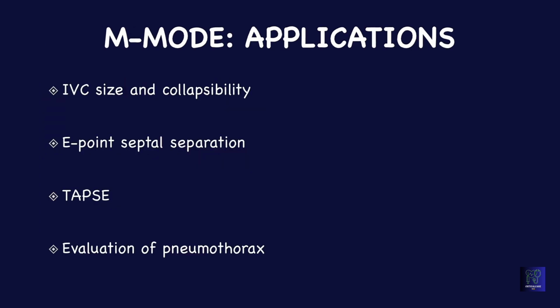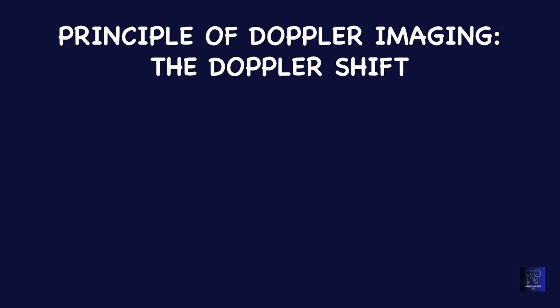M mode has several applications, particularly for cardiac ultrasound. These topics will be covered in separate videos. Now let's understand the concept of Doppler shift. Let's take, for example, a static object like a parked car. Let's say this starts making sound.